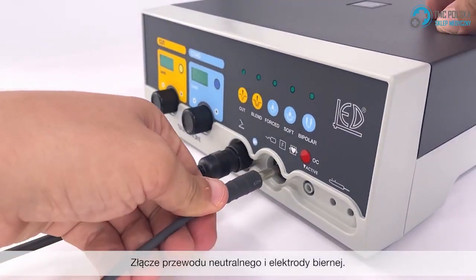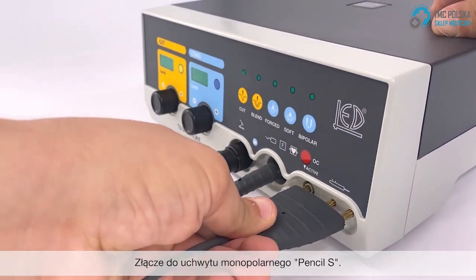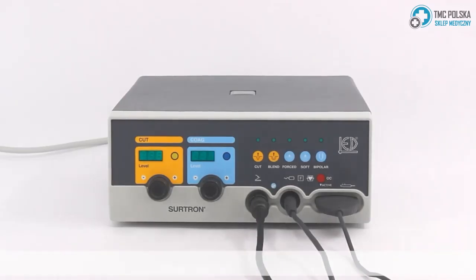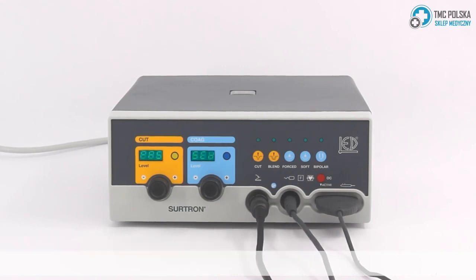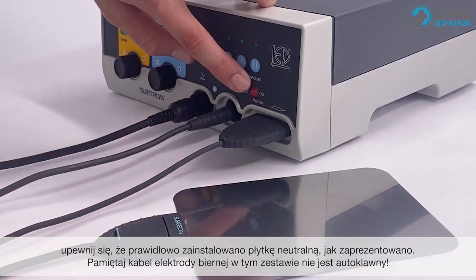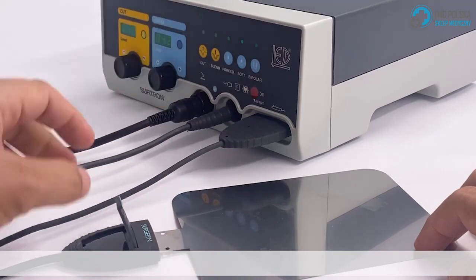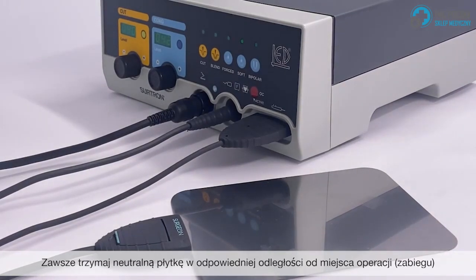There is also a connector for your neutral cable and electrode, and the connector for your monopolar handle. Make sure to keep all your cables untangled to avoid sending interference back into the device. When turned on, your device will do a startup check to ensure all the accessories are working properly. The red light labeled OC will indicate if your neutral cable and plate are functioning properly. Make sure to correctly insert the neutral plate as shown, and always keep the neutral plate within a reasonable range of the operation site.